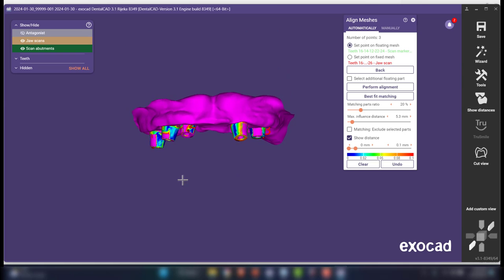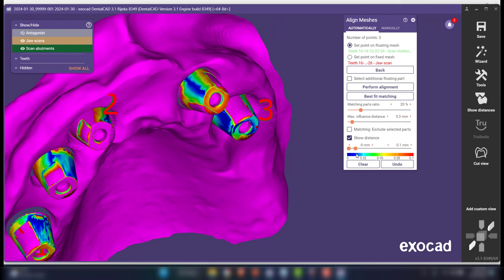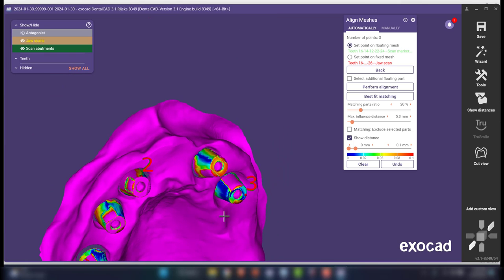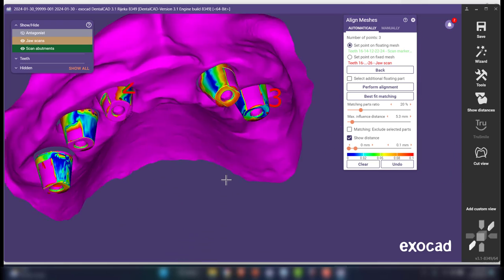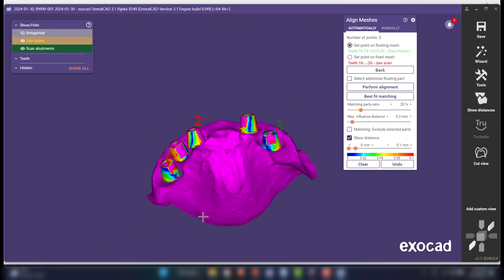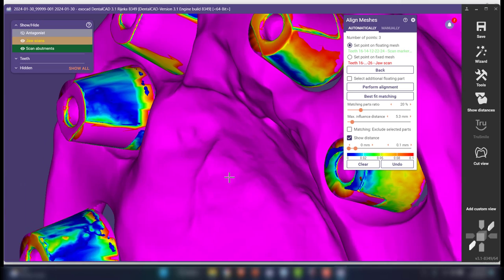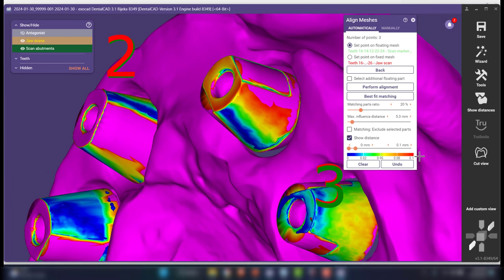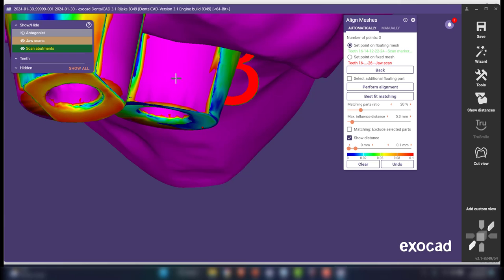All right, and so here you can see the little color map, and the blue indicates that we've got a stitch of right around 0.01 millimeters. That's highly, highly accurate. And to be sure, there's a lot of areas on this scan where there's a 0.01 match. That's great, right? And that does speak to the accuracy of that Shining 3D intraoral scanner that I was using, but it's still not good enough because you know what else I see? I see areas that are red, and that's up to 1/10 of a millimeter off. Okay, and then obviously in the areas of the flats, it's not even close because those flats don't exist on one of the scans.